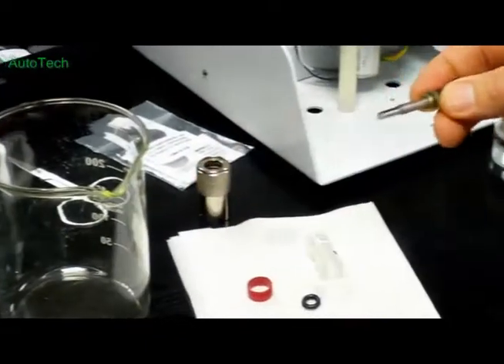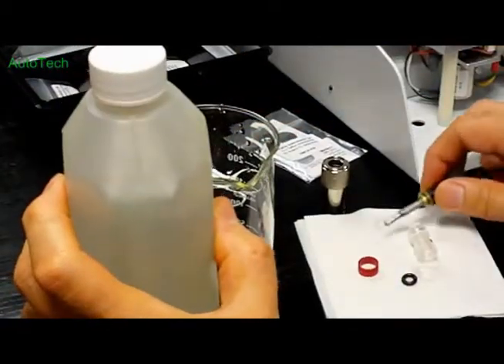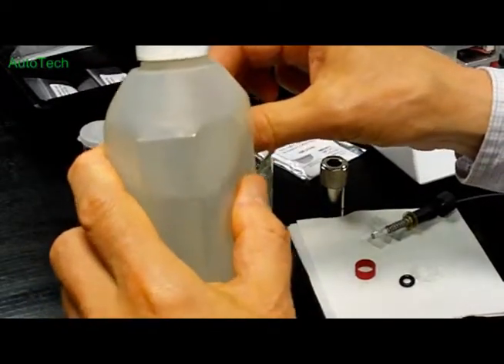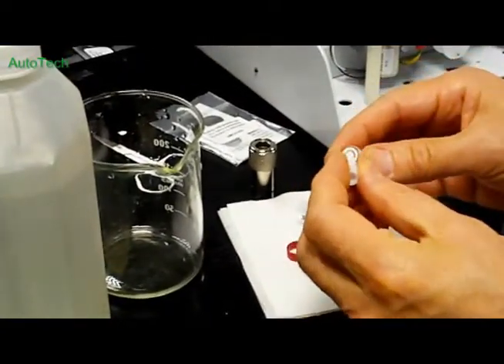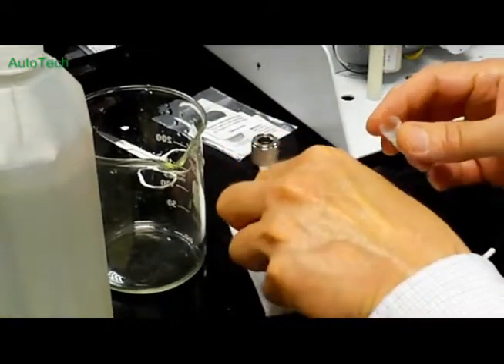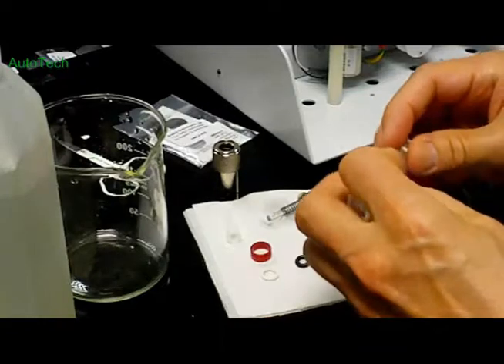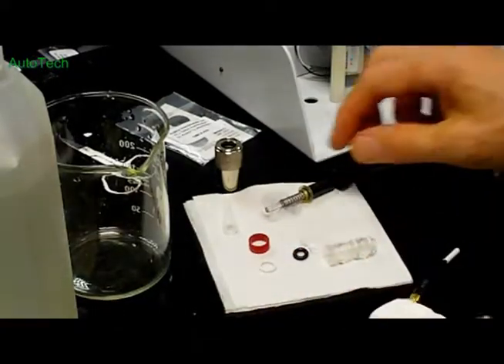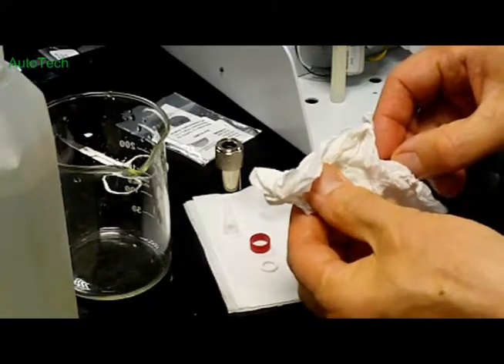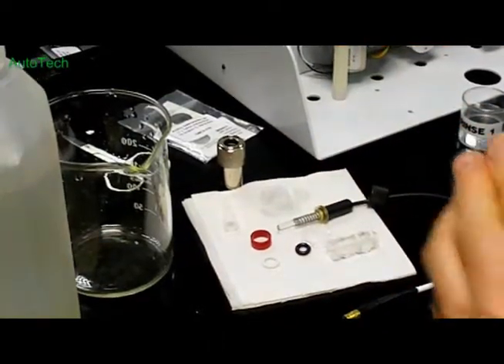And now we're just going to rinse the electrode parts with distilled water, and we'll do the jacket as well. And then sometimes the body O-ring is left in the body jacket, so just remove that with the O-ring tool, and then just dry all the component parts thoroughly. Being very careful not to damage the silver coil on that part of the electrode. And so now we're ready for reassembly.